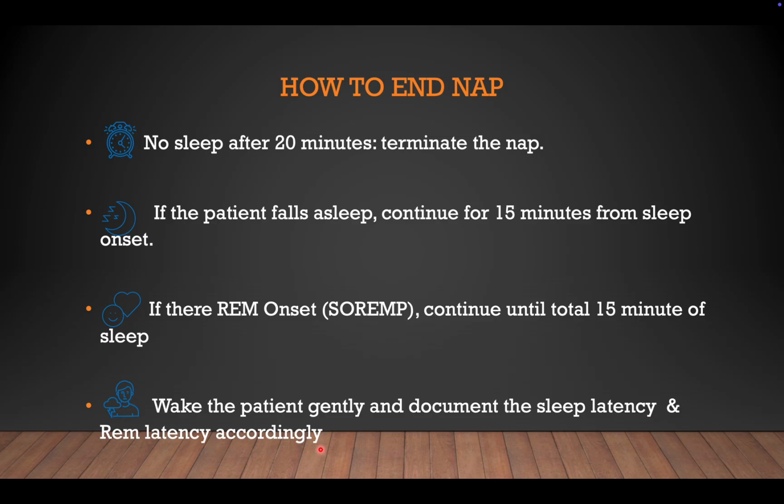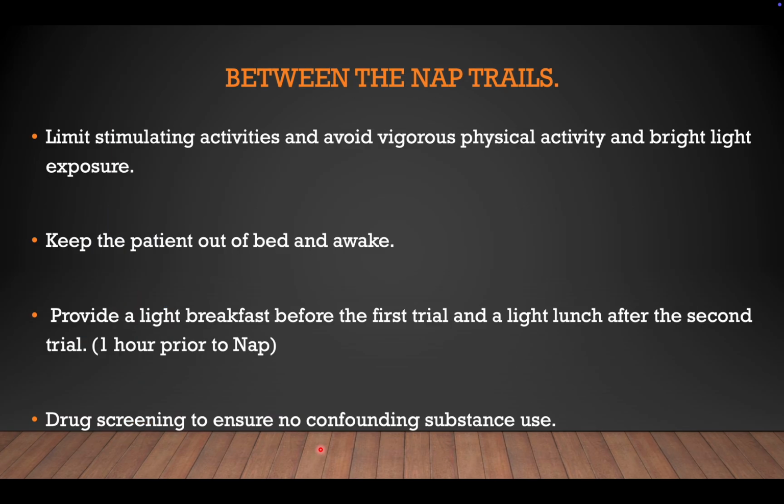Then, based on the start of the first nap, for example, if this nap started at 8 a.m., we will start the next nap at 10 a.m. Between the nap trials, what does the patient have to do? Limit stimulating activities, avoid vigorous physical activity, and avoid bright light exposure.